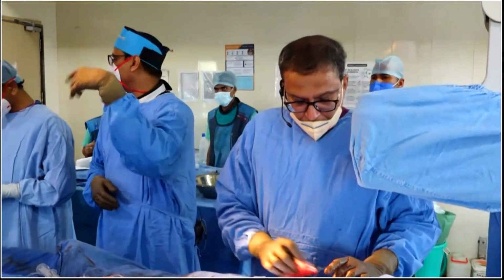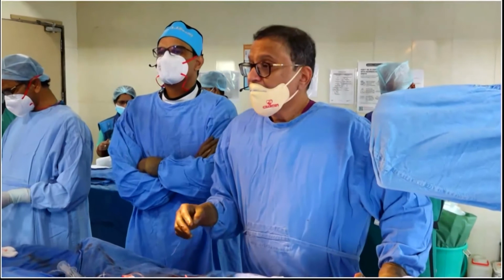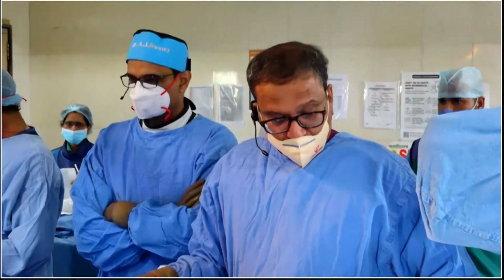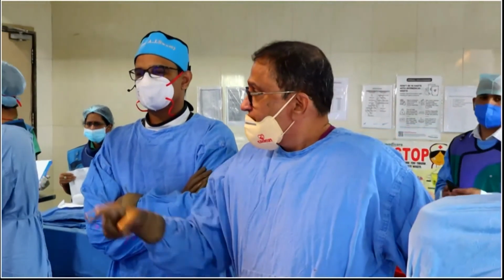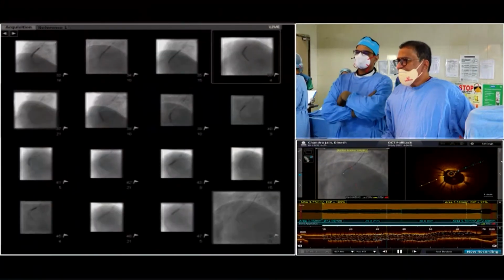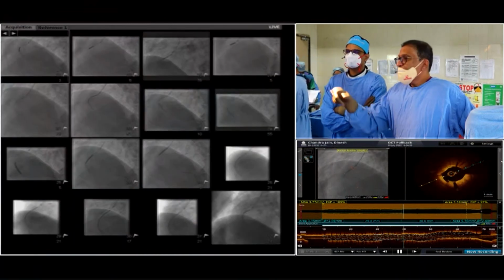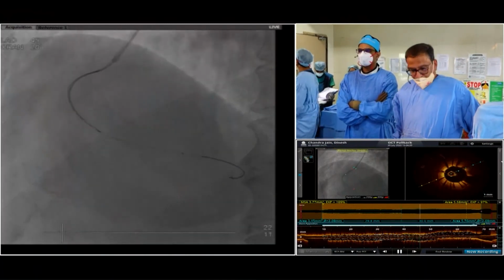Okay, so you're now back, and you could show us the OCT pictures immediately after implantation of the second proximal stent. Dr. Ajay, you're live. Can you go back to the stenting? I think we left before stenting or after stenting. Where did we leave? The proximal stent was being deployed. Can you go back to the proximal stent?